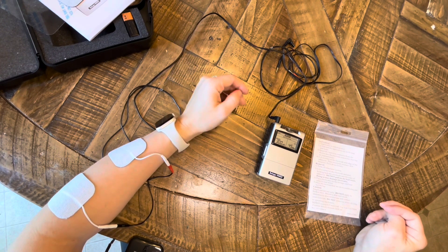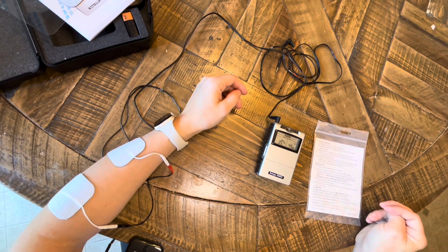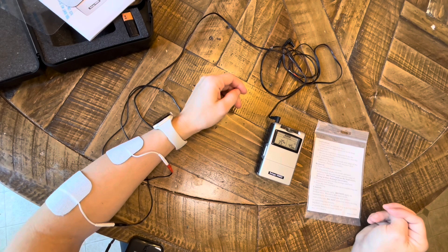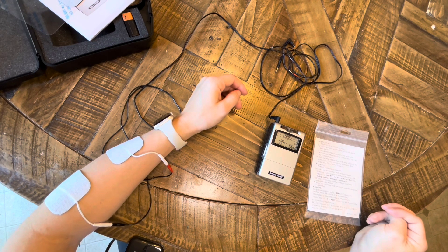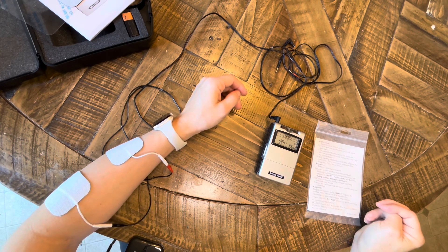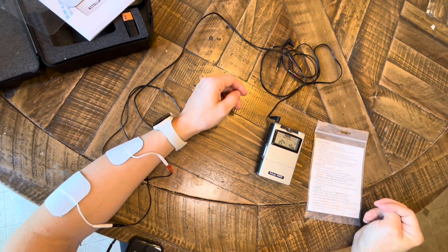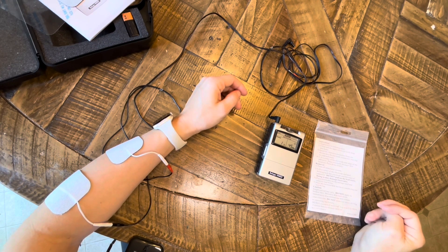So as you can see I'm getting pretty good finger extension, so it's right where I want that amplitude to be.